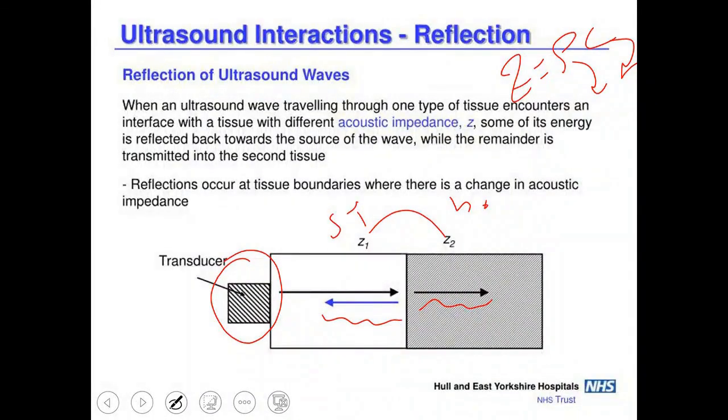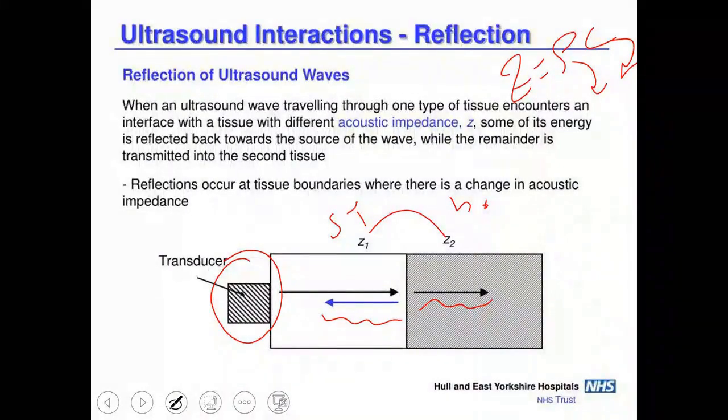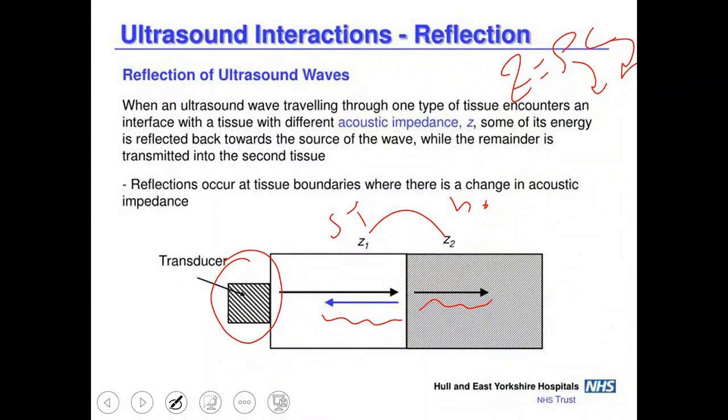Or conversely, it could be in terms of transmission and absorption, in terms of artifacts such as shadowing and enhancement, in terms of signal and representation, in terms of strength and weakness.